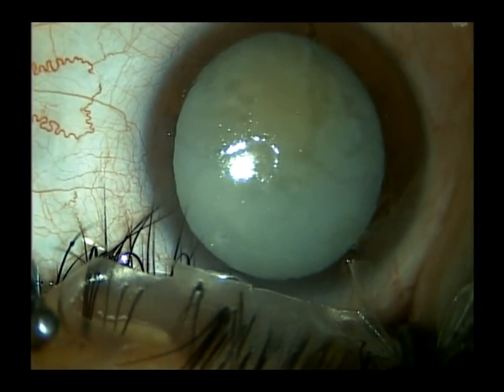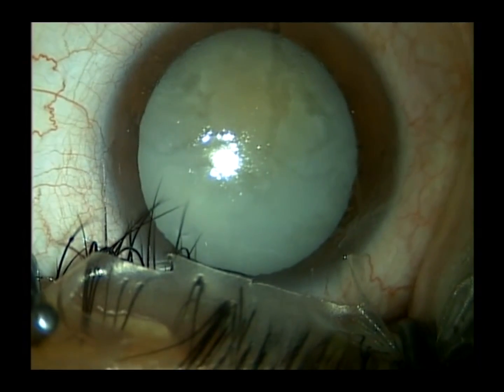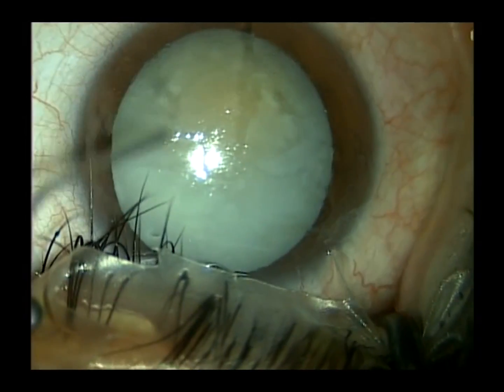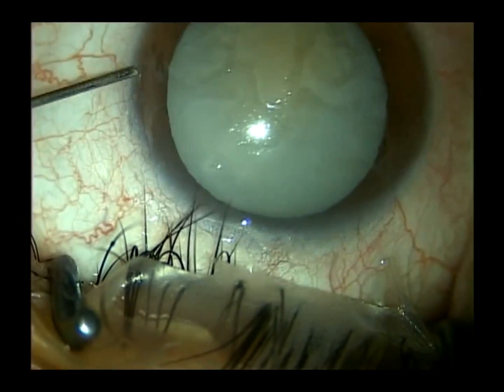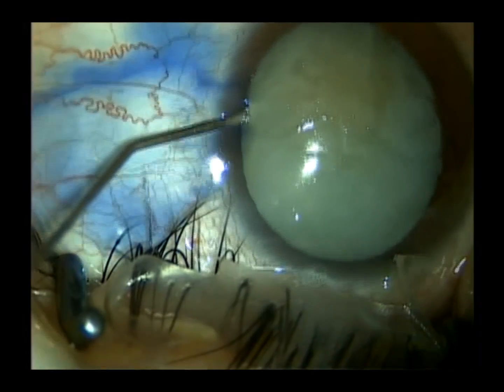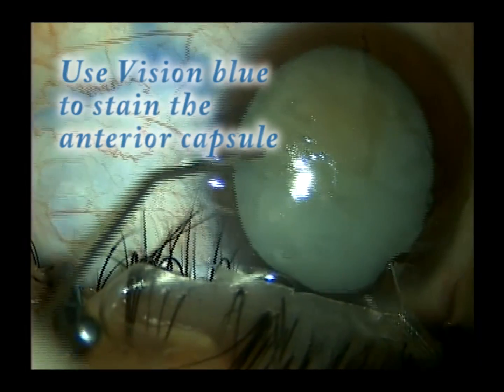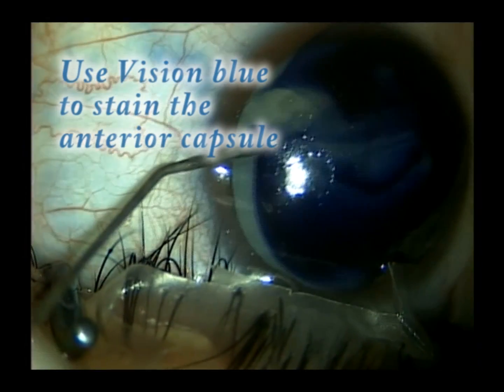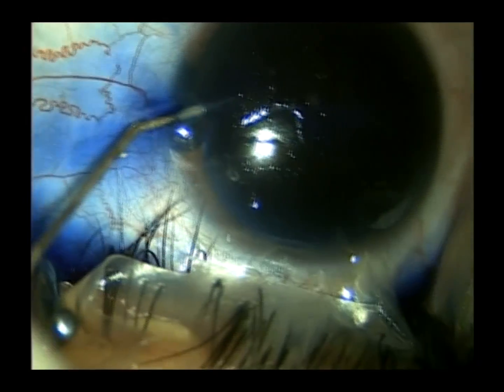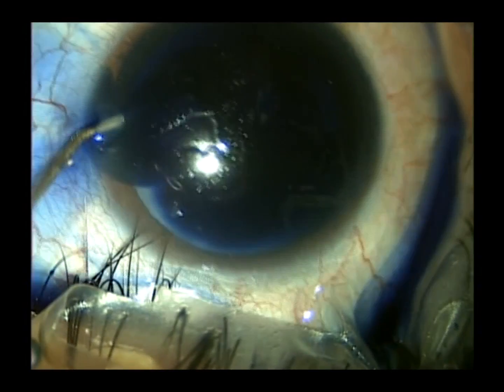He's already received a little Valium and has had 1% xylocaine applied to his eye. We've created a small paracentesis already at the 9 o'clock position and a peritomy at the 6 o'clock position, and we're just staining the anterior capsule with Vision Blue.